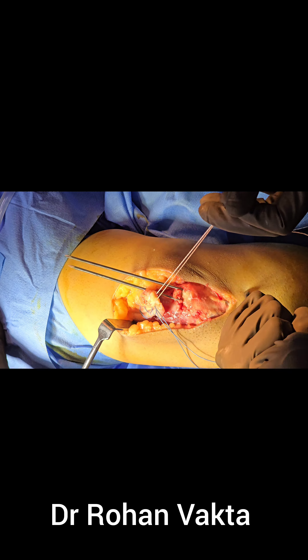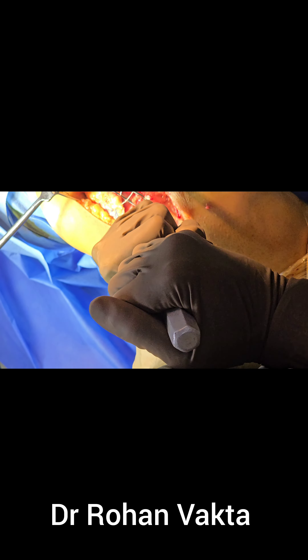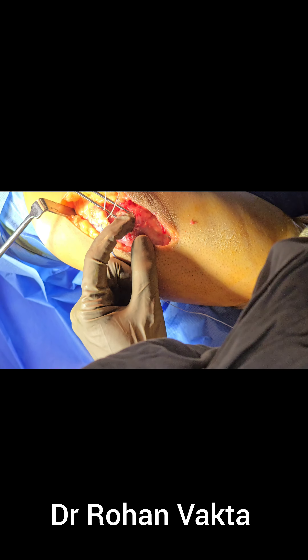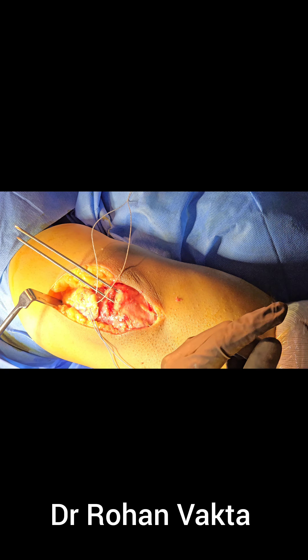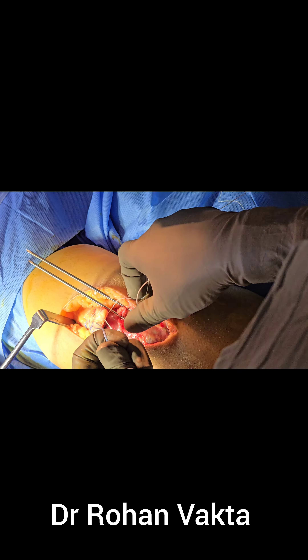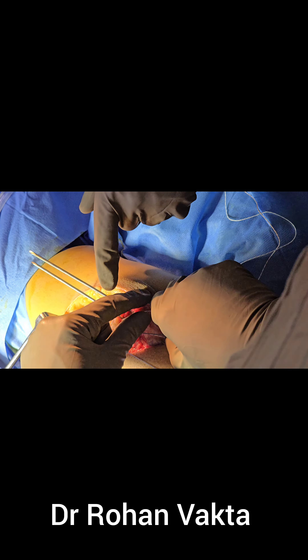A bleeding bed is prepared at the olecranon process. Two number two size K-wires are passed through the olecranon process — one from medially and one from laterally. These two K-wires will be used to pass the fiber wire through the transosseous tunnel.